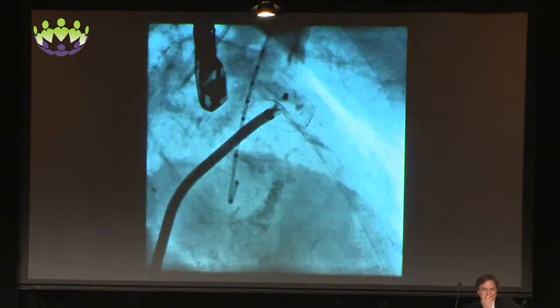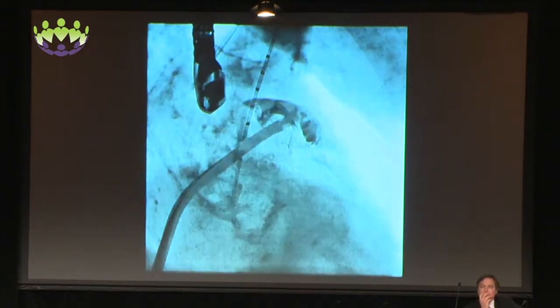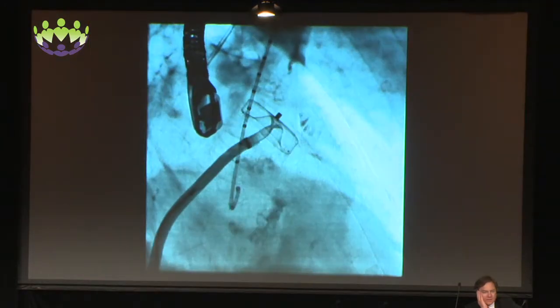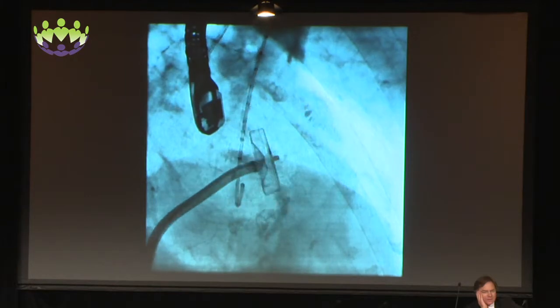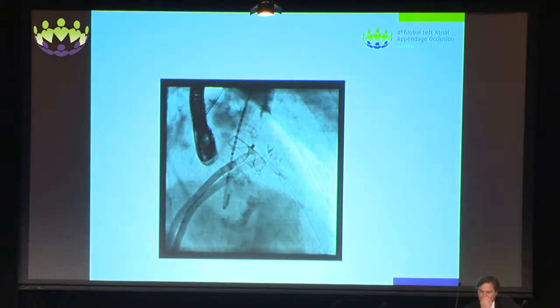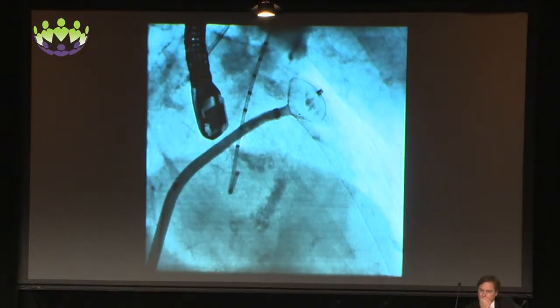I can see my device angulation is too superior, and that in fact what I'm getting is occlusion distally, but I'm not convinced that I'm actually going to be solidly hooking up there. So I then, just for the sake of it, you can see it's already out, but retracted it back out in order to collapse it, and then repositioned. So I'm not going to ask you whether you should reposition or upsize because I'm already at 30.